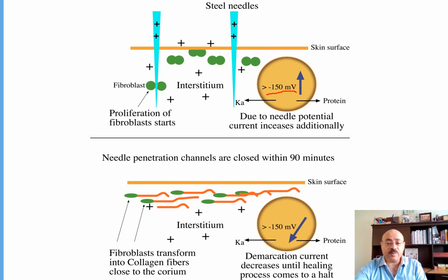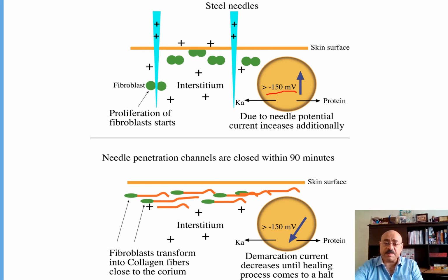They found also that when we insert multiple needles into the skin, there is migration of fibroblasts because there is an acute inflammatory reaction happening in the skin. When fibroblasts migrate to the area, those cells are responsible for new collagen formation. In addition, when we are inserting multiple needles into the skin, there is increased blood supply and blood circulation in this area. With blood circulation, we get more nutrients and more growth factors. So those are the mechanisms of action of microneedling.